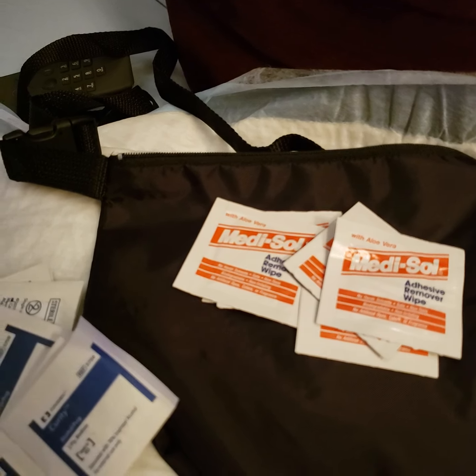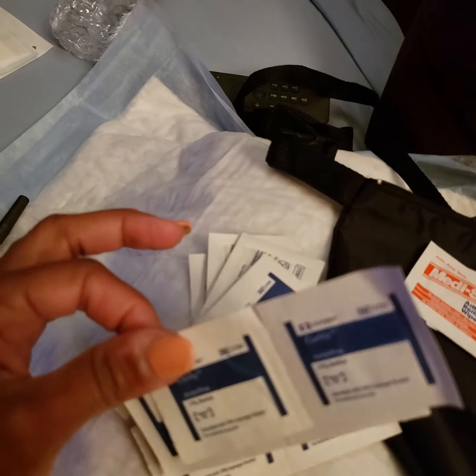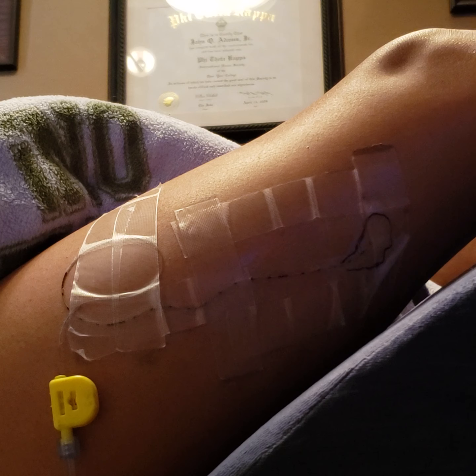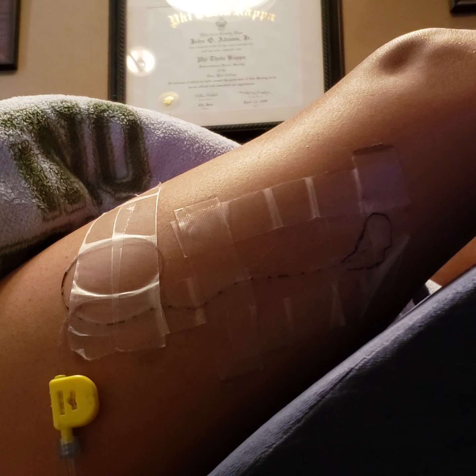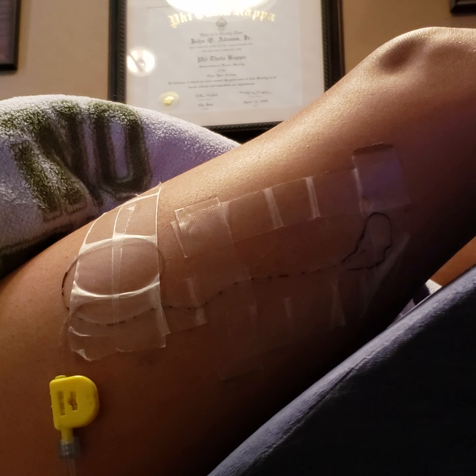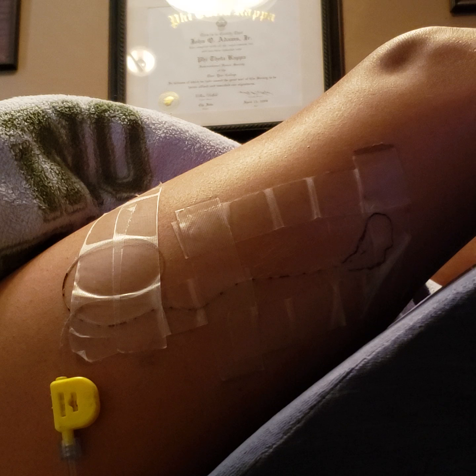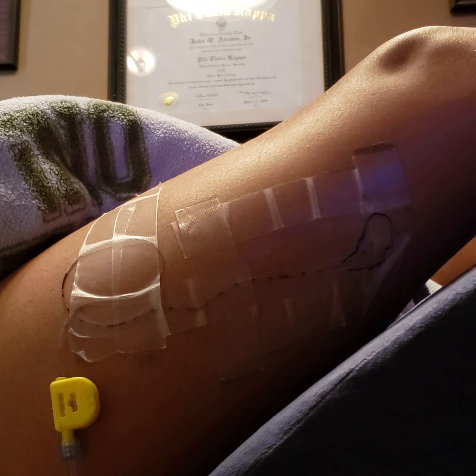The worst part of this is removing the tape, and as long as you have adhesive removal wipes — or alcohol wipes, which work just as fine — please don't try to remove this without either of these because that's just torture. I have the adhesive remover here, and this is the most important thing so they don't feel too much pain.